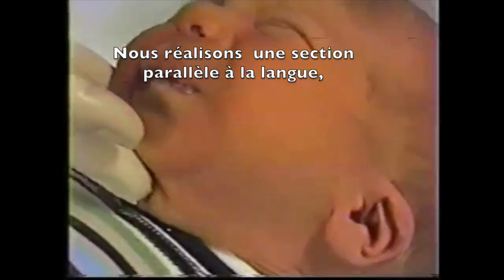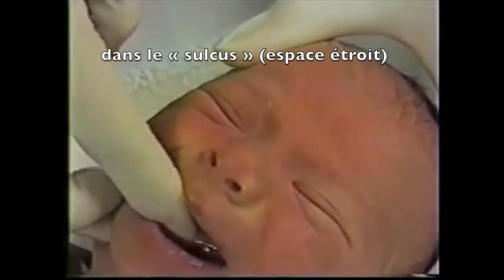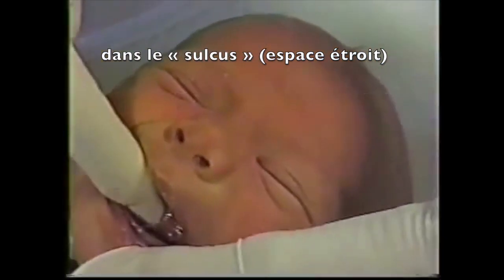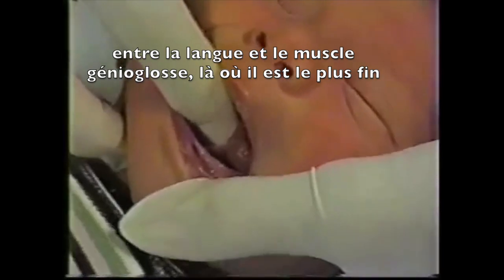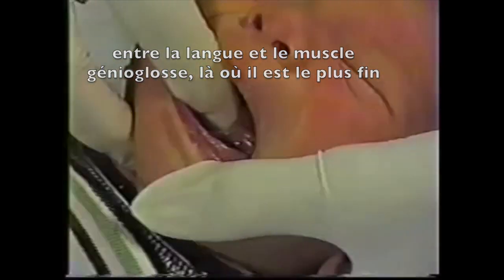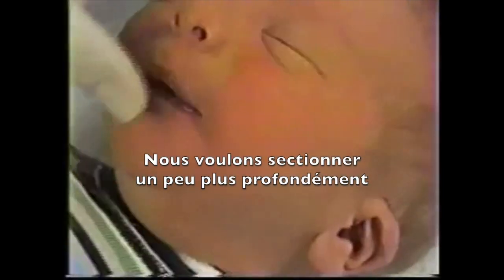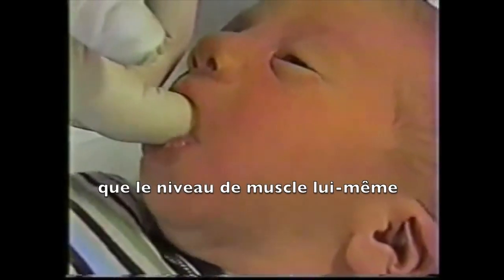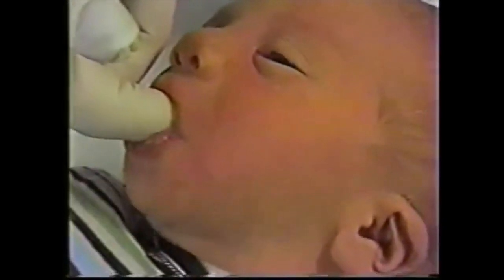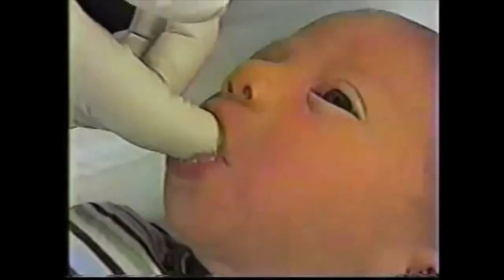The place that we want to snip is between the tongue and that genioglossus muscle. We snip parallel to the tongue into the sulcus between the tongue and the muscle where it's at its thinnest, so that we get the least amount of bleeding. And we want to go slightly deeper than the muscle itself so that it's well detached from its attachment to the gum line.